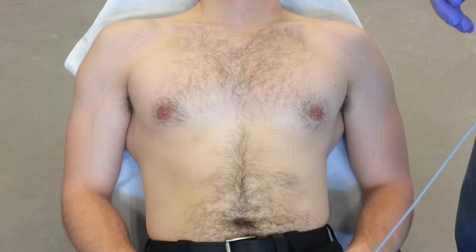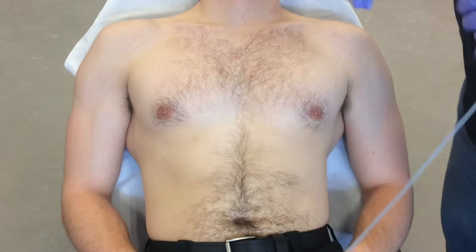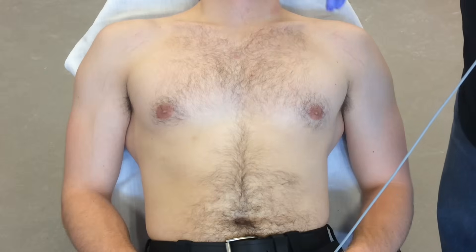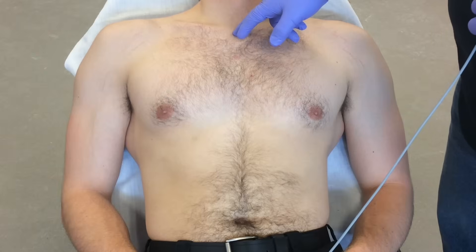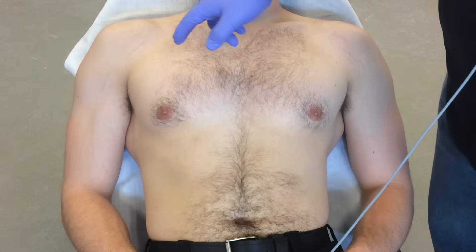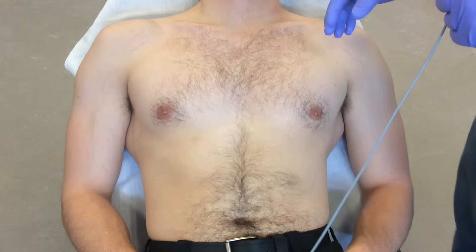This is the technique I use for landmarking for 12-lead ECG. It's a little different from a method a lot of people use. A lot of people use the sternal notch and then look for the angle of Louis and go across, but there's a much easier way to do this.